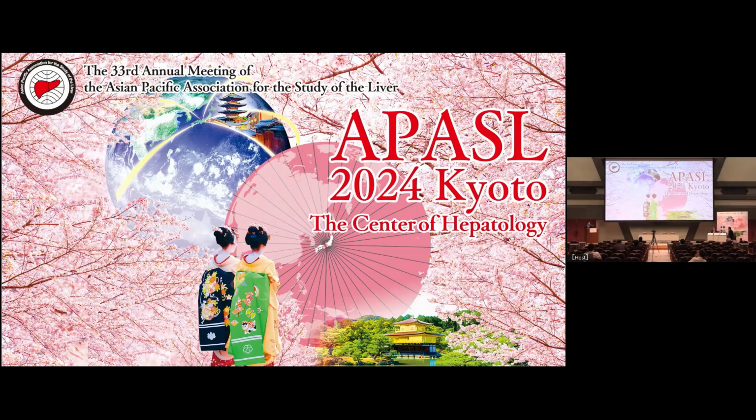Yes, forward-viewing EUS, only in a special situation, segment 7. Segment 7 is very difficult, very far from the duodenum. So we can push the scope too much, and sometimes we can puncture segment 7. But in this situation, it's very difficult, so I don't recommend it. Visualization with the forward-viewing scope is a little bit difficult. So the Fuji scope is better. This is my opinion.